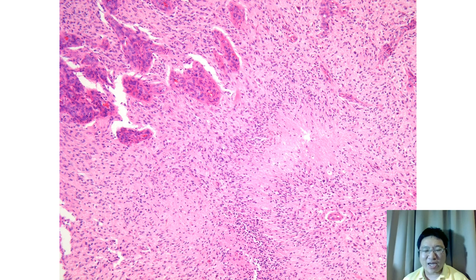This is glioblastoma. Previously, it was called glioblastoma multiforme, but nowadays we just call it glioblastoma. And do you remember all the four criteria for making the diagnosis of glioblastoma? AMEN. A, atypia or anaplasia. M, sorry, mitosis. E, endothelial vascular proliferation. N, necrosis. We must see all these four changes in the tumor in order to make the diagnosis of glioblastoma, which is grade 4, WHO grade 4.